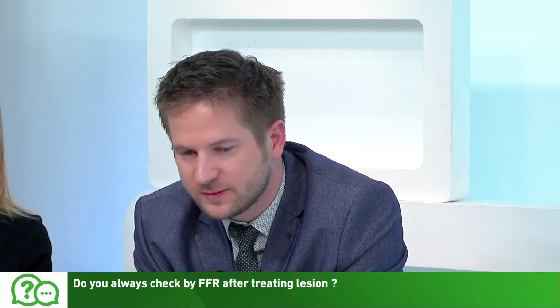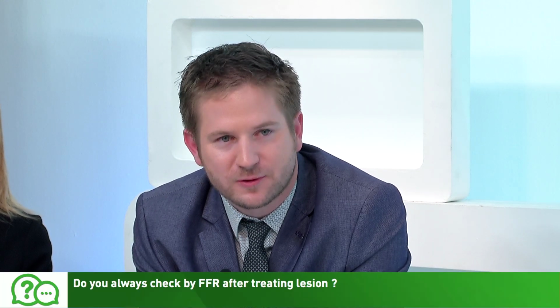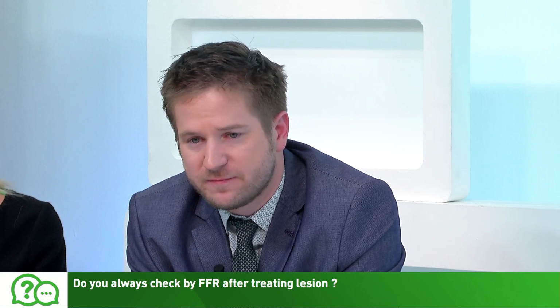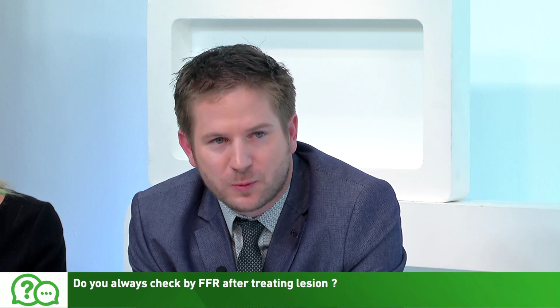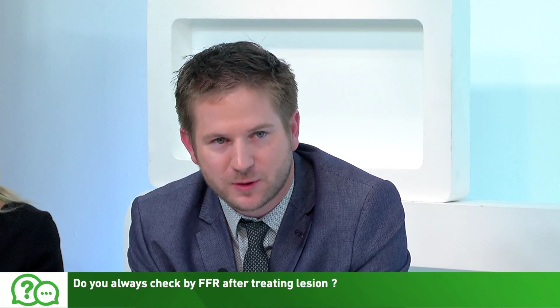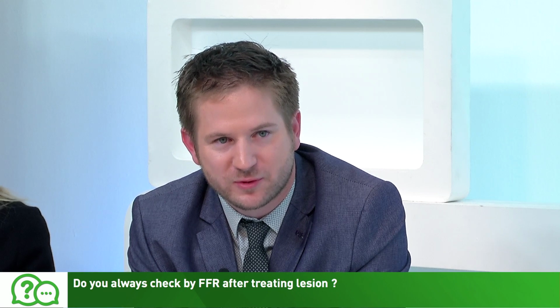Of course, sometimes it's not feasible. There was a contrast load, or your wire is destroyed already. You cannot use it. There are cases again and again when you decide for good reasons not to do that. But if you can, if it works, why not? Then you really get information on where you started and where you end, what the patient benefited from your procedure.